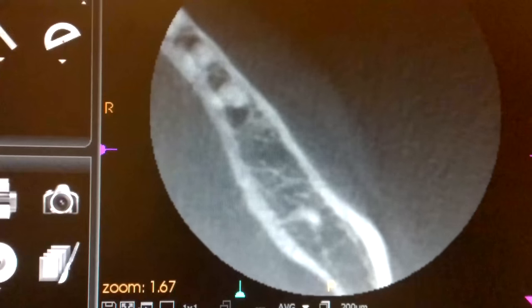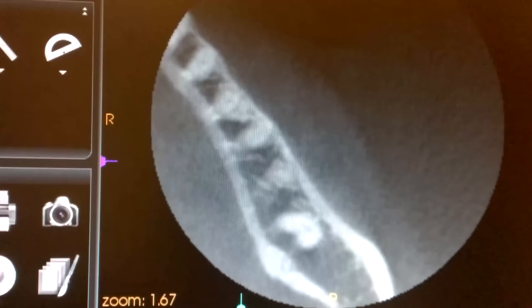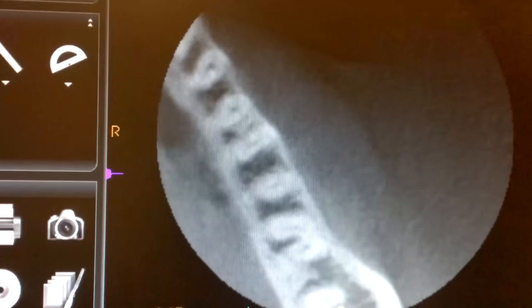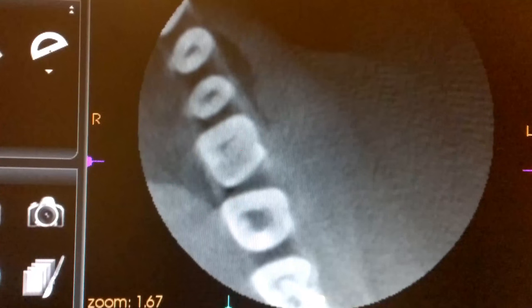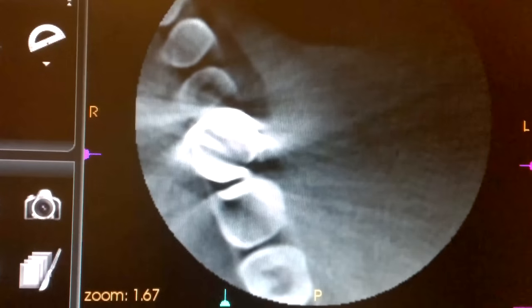So in reverse, you can start to see the two roots forming, and then right here they meet. Then you can start to see the caries right in here that is underneath this crown, and then we come all the way up to the occlusal surface.